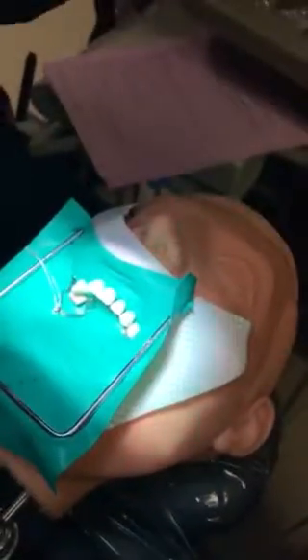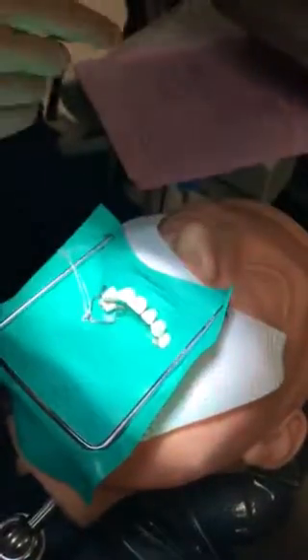So now I'm going to pull these teeth over, and sometimes the holes get stuck in between the teeth. So you really got to make sure that you pull over correctly. And I see my lateral is kind of down in between the teeth, so I'm going to pull that up. So I pull that one over my lateral. Then I got my canine, and then I got my first premolar. And you notice I'm just mainly using these 2 fingers to manipulate the material. Then I'm going to get my next clamp.